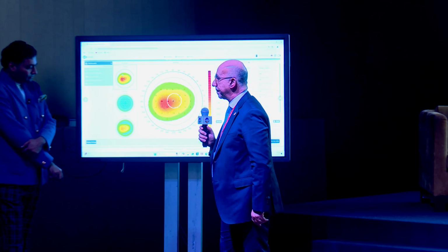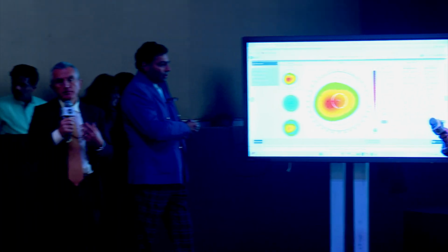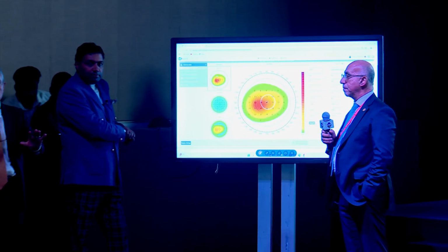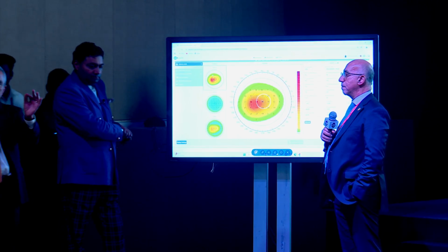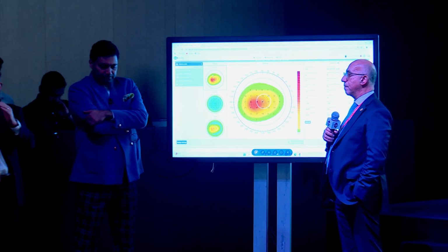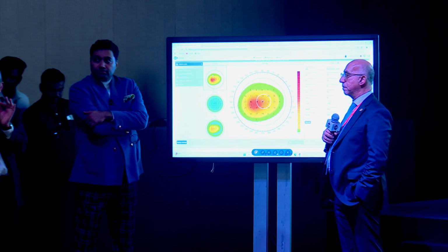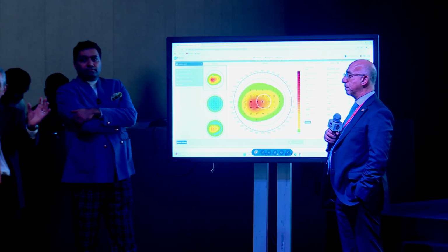Yeah, as Professor Shafik said, our approach is really a holistic approach. So we want to get optimized quality of vision, but simultaneously minimize the thickness removed. This means that we are not printing a lens on the cornea, but basically designing the ideal shape, just removing the tissue which exceeds. You know very well that, for example, in a cone, the posterior is bumped. So this means that we do not need to remove completely the bump of the anterior in order to compensate it. And by reducing the refractive zone to what is really needed by the patient, we save quadratically, because the ablation is quadratically proportional to the diameter of the treated zone.